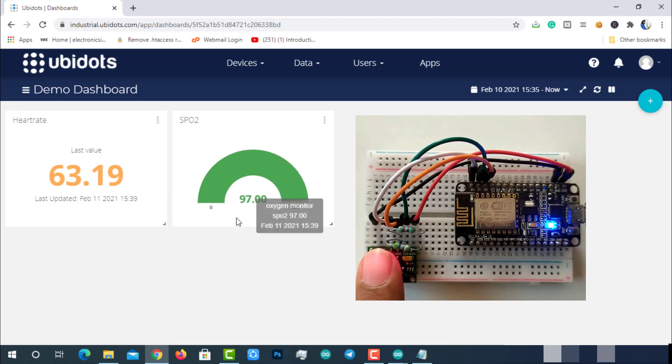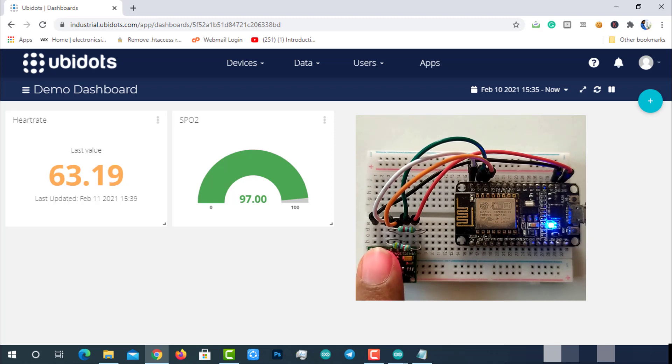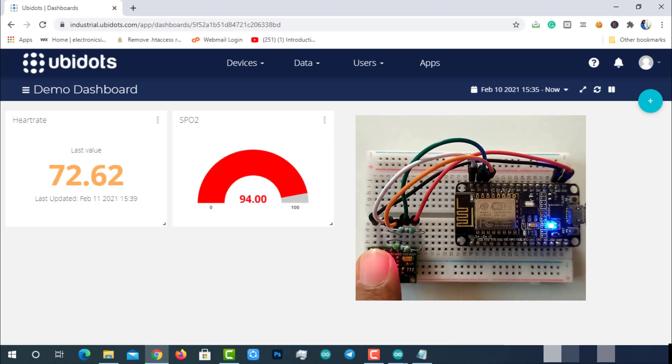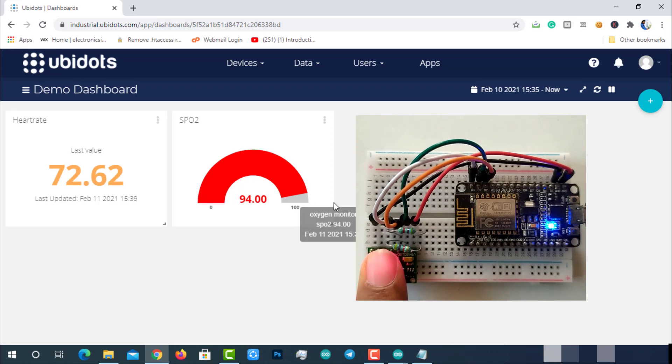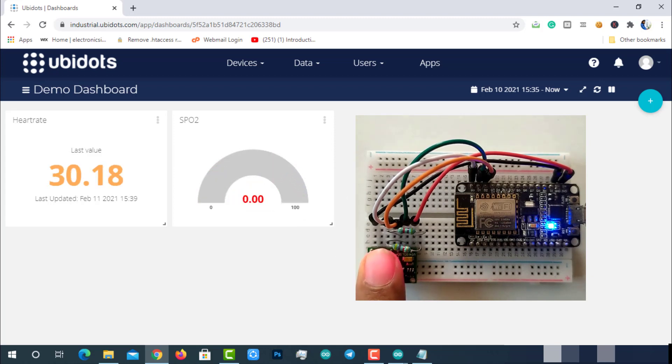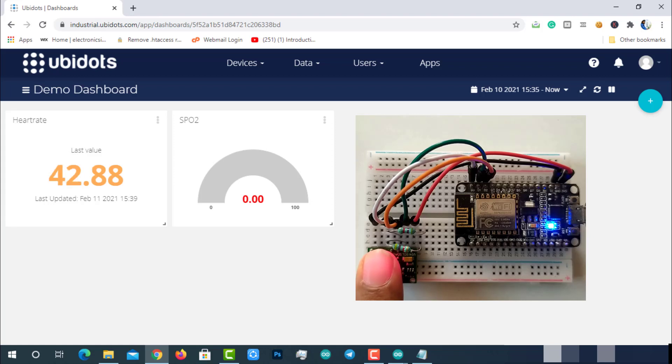To demonstrate, I am moving the finger to create fake abnormality in the readings. So it perfectly worked - you can see the data in red color.